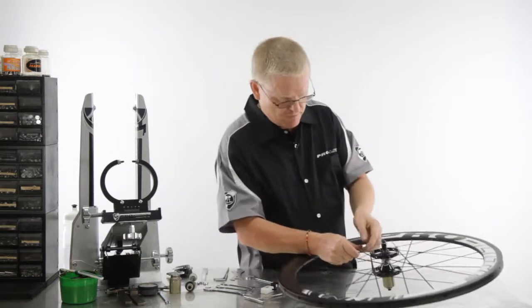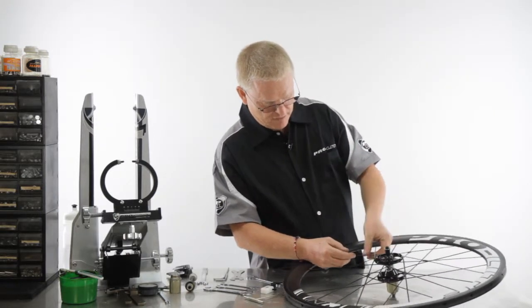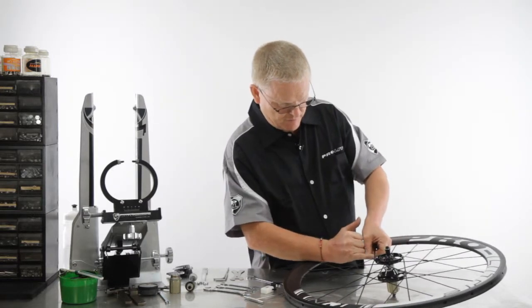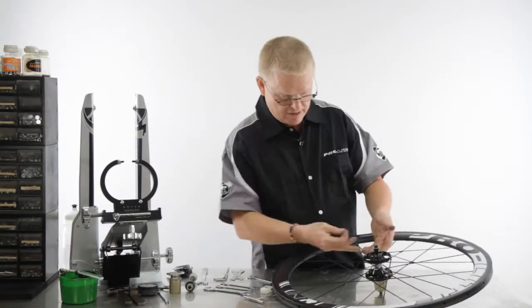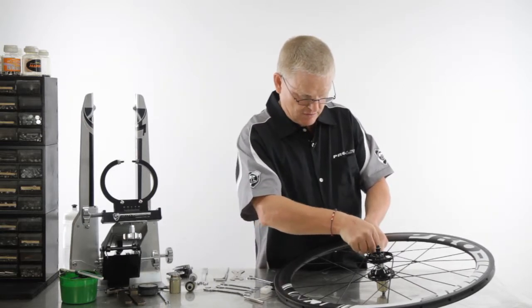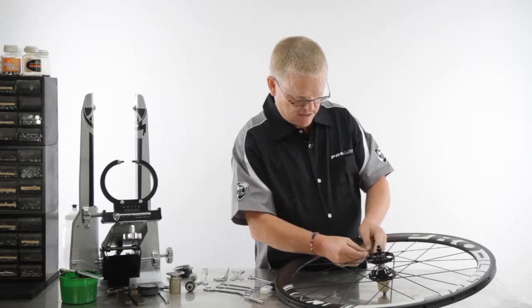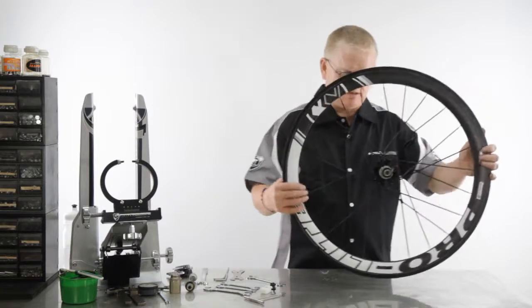I just want to show you very quickly how to remove it and replace it. I've got my first finger here, my thumb there — just push the spokes slightly apart, push that up, and with my little finger it's come out and it's free. To reassemble, it's very easy — it's slotted on both sides. You just prise the spokes apart, slide it into place like so, and you can hear it pings as it sits back home again.